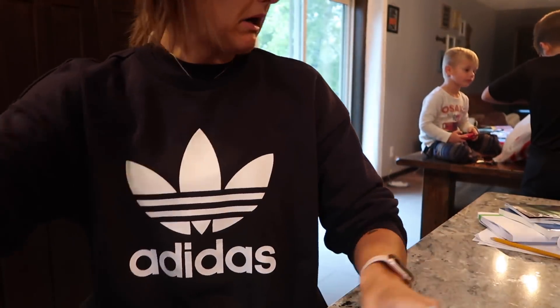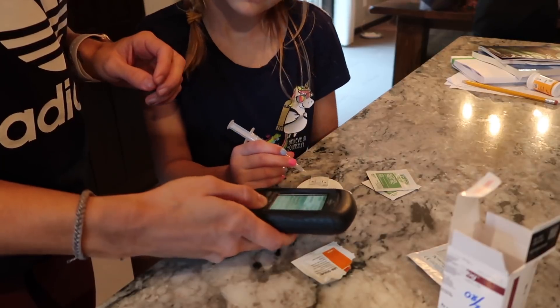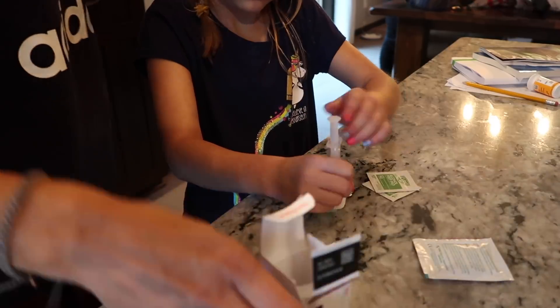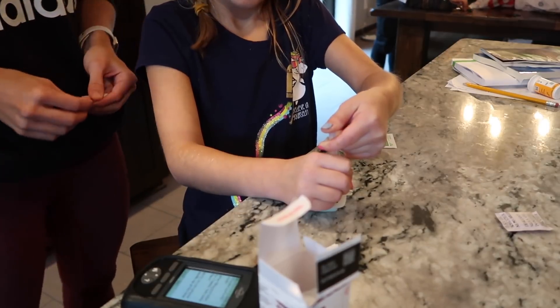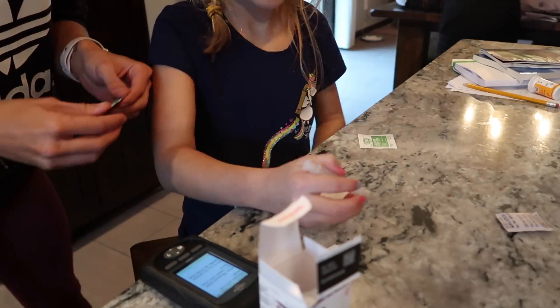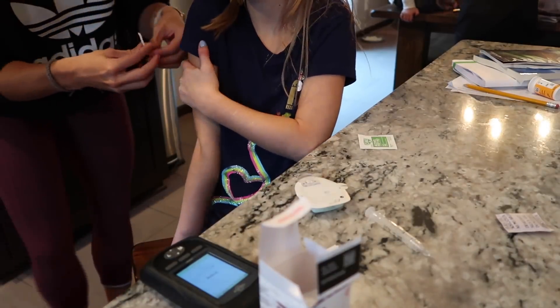Mom, can you do this? Where's the pod? I didn't open it yet, Dad. Just wait. Let's do next. Activate. Yes. Fill new pod with insulin. You want to do this arm or this arm? It's priming. Let's do some alcohol.